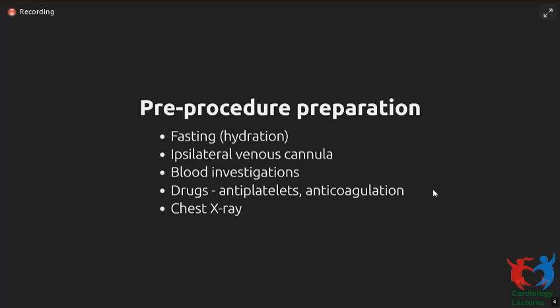As regards anticoagulation, most of you may be aware of changing trends in management over about the past 10 years, with a lot of evidence accumulated that oral anticoagulation is much better, both in terms of reducing bleeding complications and reducing thromboembolic complications, compared to a strategy of heparin bridging. So almost always now we continue with anticoagulation. Depending on the thromboembolic risk in a particular patient, you may decide to do the procedure with full anticoagulation, maintaining therapeutic INR, or withholding for a day or two to let the INR drop to somewhere between 1.5 and 2.